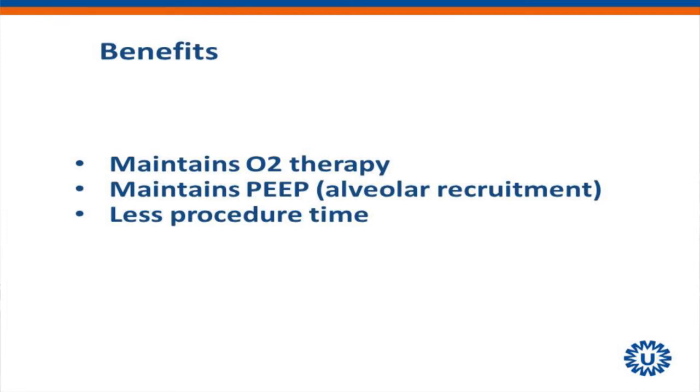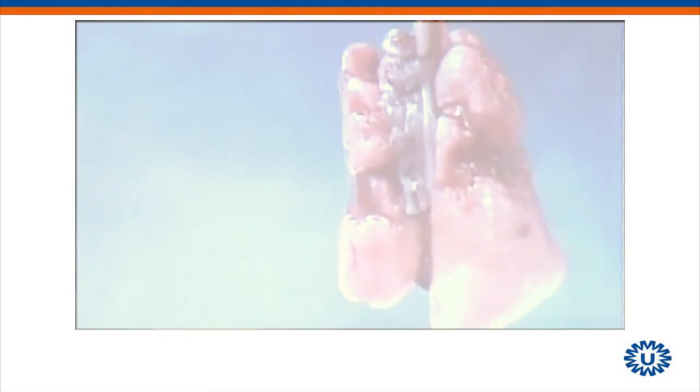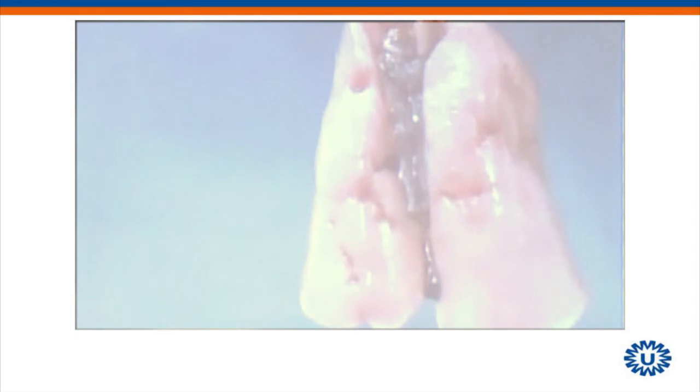Why is it so important that we maintain PEEP? Anton showed us this morning a movie of a couple of alveoli ventilated with a low PEEP and with a high PEEP. This is another movie, where you can see a lot of atelectasis there and there, and every breath they are giving someone more PEEP until all atelectasis is gone. Some here.